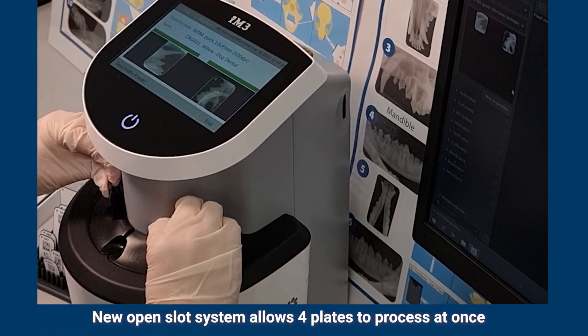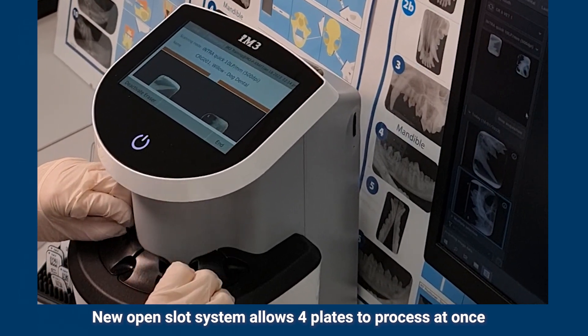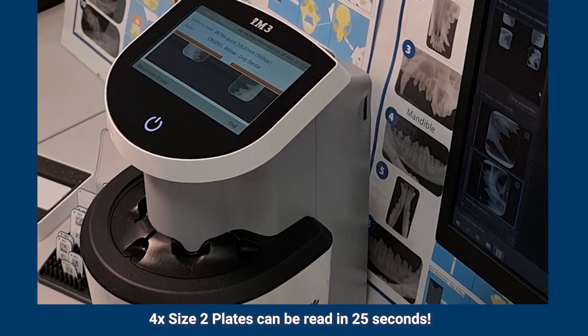The new open slot system allows four plates to process at once. Four size two plates can be read in just 25 seconds.